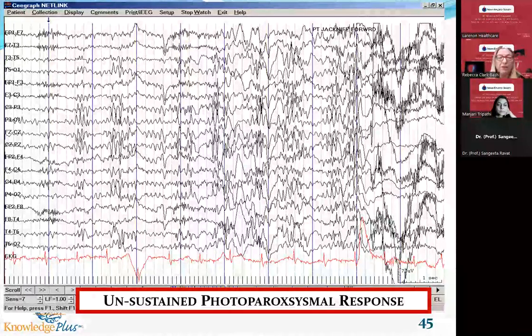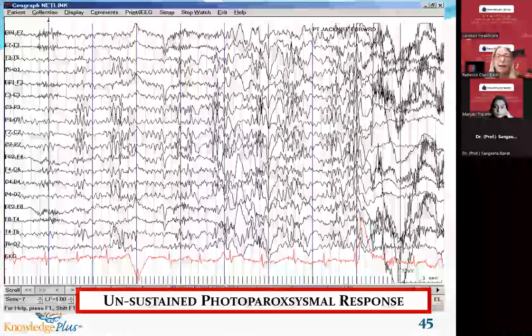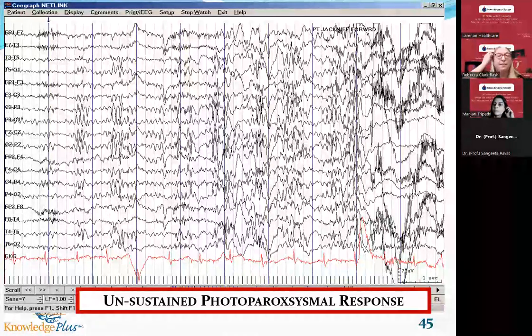Now, me personally, as soon as I saw the activity in two and three, I would have shut that stimulator off. Now, that didn't happen. Remember, I'm not there teaching that tech. I'm there teaching new techs. She is an experienced tech doing this recording. So as I am watching this in second three, I'm getting very nervous because if that young man went into a generalized tonic-clonic seizure, the damage to his arms and legs could have been quite severe.